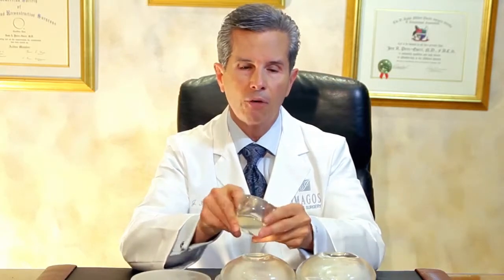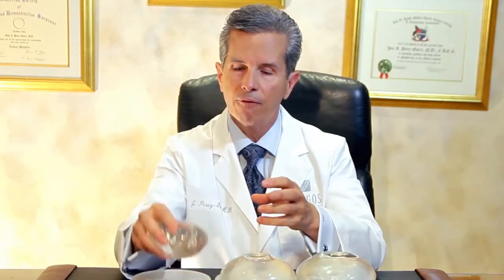First of all, the saline implant is an empty bag that can be rolled and folded, and can be inserted through a very small incision in the areola, the fold, or in some special cases through the armpit. Once it's in place, it's filled with the desired volume of saline. Silicone is very different. You can't fold it, you can't roll it up, and therefore the incision has to be made slightly larger, and unless the woman has a large areola, it has to be made down here in the fold.